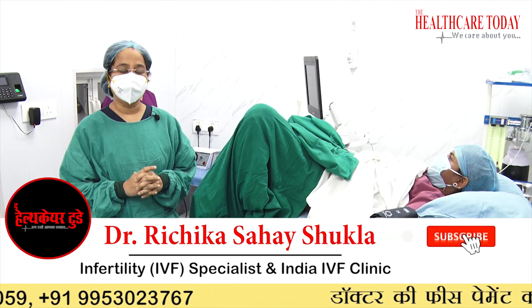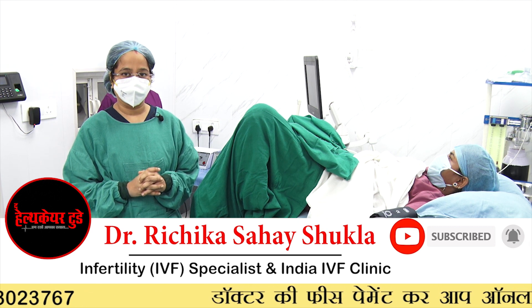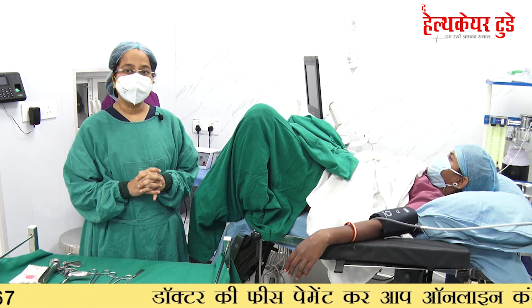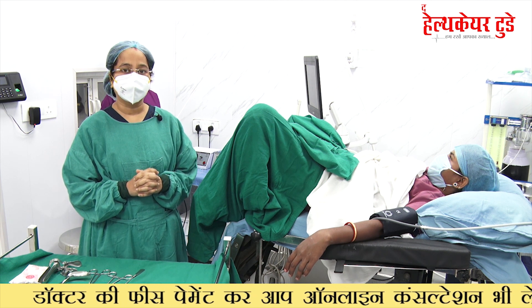Today we are going to show you how the ovum pick up procedure is done. It is an integral part of our IVF procedure that we commonly call OCR — Oocyte Retrieval — or OPU, which means ovum pick up.